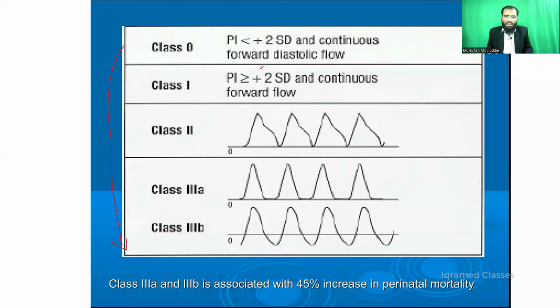Sir, I have seen REDV type of waveform in dorsalis pedis Doppler. It means the blood flow got reduced. Reversal of end diastolic waveform in dorsalis pedis Doppler. Okay. Dr. Rashmi, this is a beautiful question, but I would like to take it up, although it's out of context of our lecture. But see, this is an important concept. It is related to the lecture today, so I'll be discussing this.